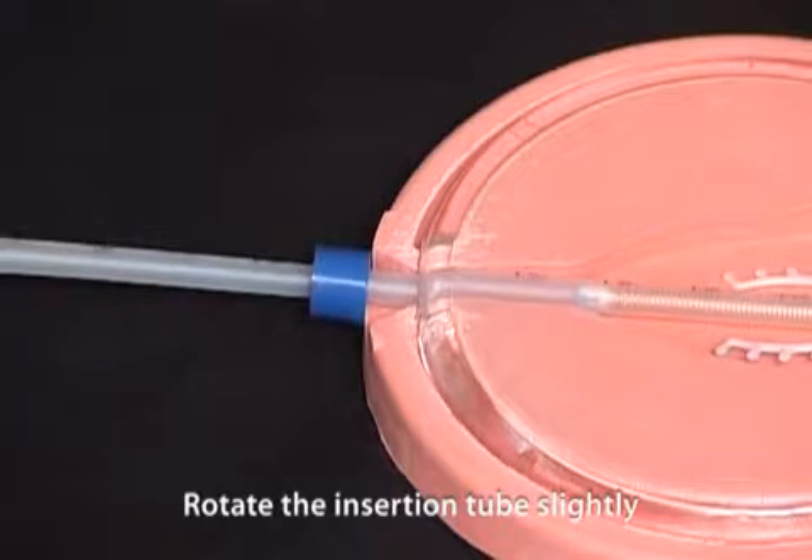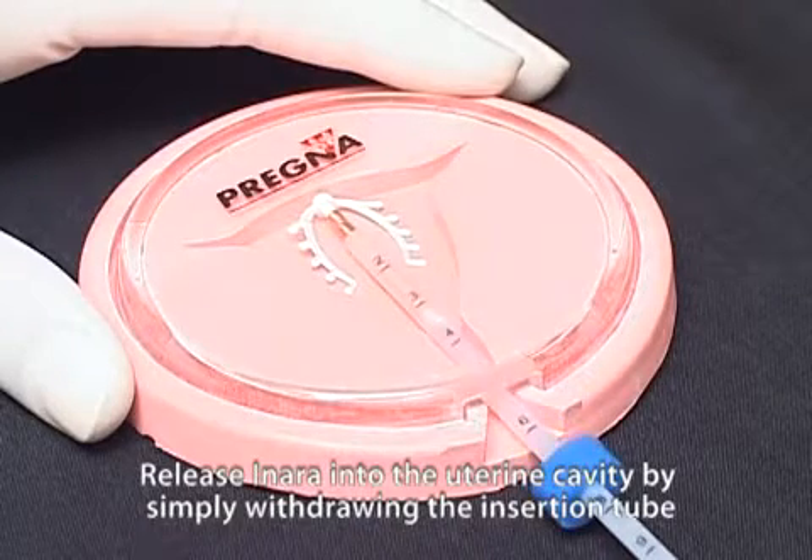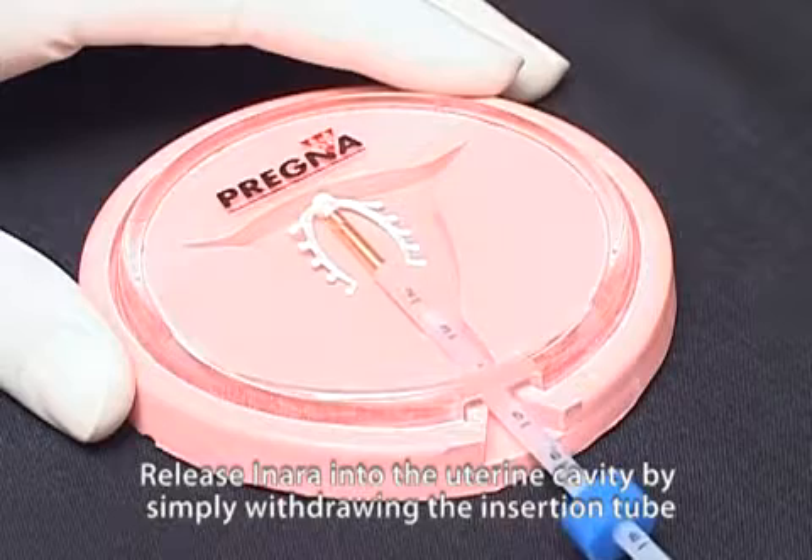Rotate the insertion tube slightly. Release the inara into the uterine cavity by simply withdrawing the insertion tube.